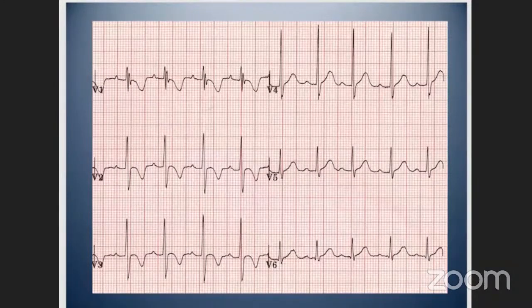So does anyone want to hazard a guess at this ECG? So this is the precordial leads, V1, 2, 3, 4, 5, and 6 of an individual. And here we can see that there is a P wave preceding every QRS complex. It does seem that that PR interval could be slightly widened. And we do have our RSR pattern. And then what we notice is that there seems to be a bit of ST segment depression in V1 and flipped T waves in V2 and V3. And so is there anything that you would like to know further on this case or about this patient? Or does anyone have an idea what these flipped waves could be?